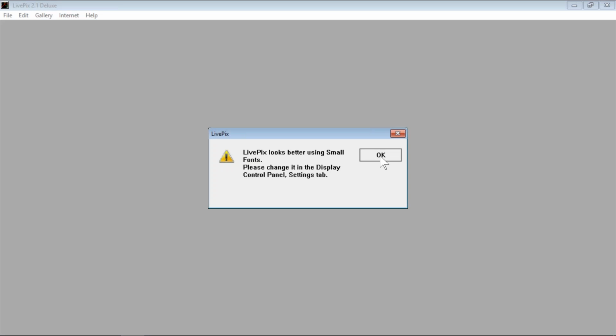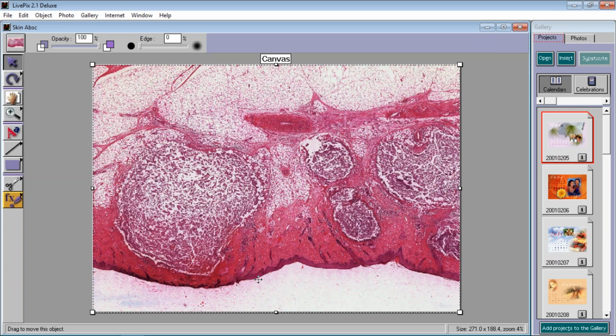You've got skin again, and I think you'll recognize it. Yep, you've got your epidermis on the bottom. You've got your dermis right underneath that, or in this case, it would be above. You might have some sweat glands here, but that's not the thing that gets your attention. What gets your attention are these big balls here. Here's a big ball, here's one, and here's the biggest one. So let's take a look at these big abnormal balls, which look like they involve not only the dermis, but perhaps even the subcutaneous fat, which is over here.